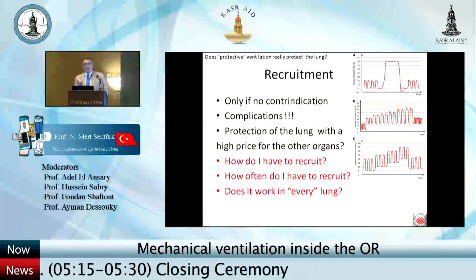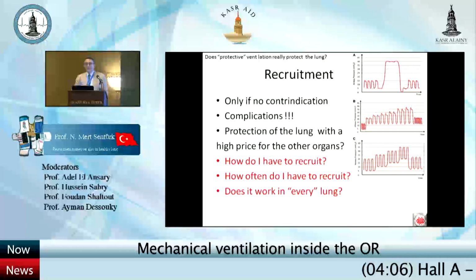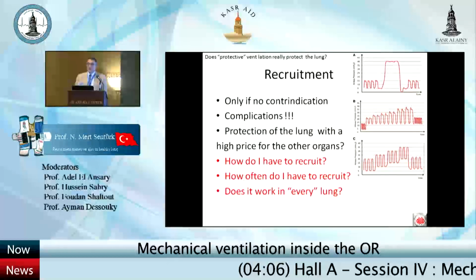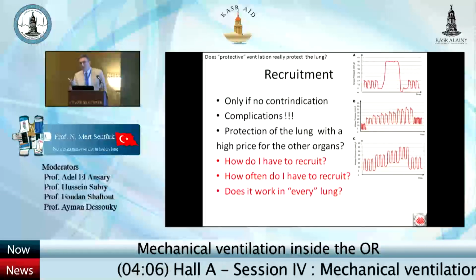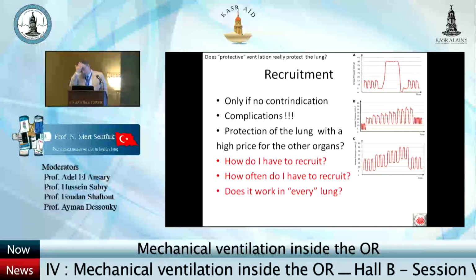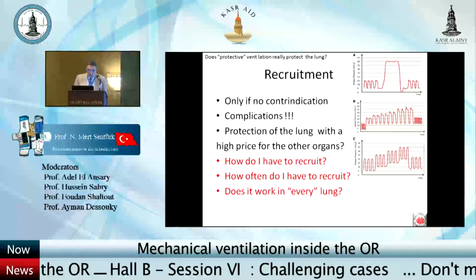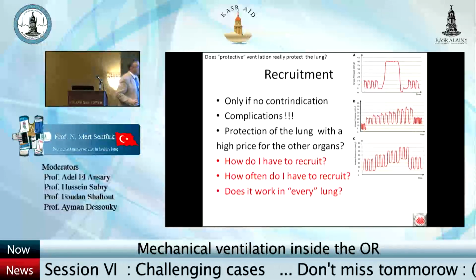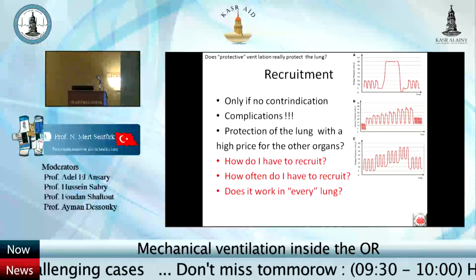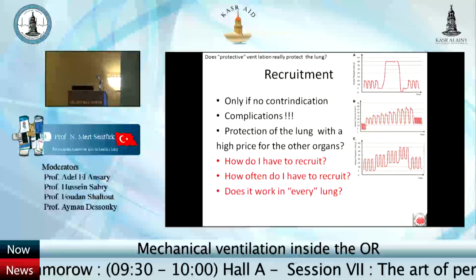Therefore, it is recommended not to use a recruitment maneuver immediately after the induction of anesthesia, because the induction of anesthesia, especially in critically risky patients, can be associated with hemodynamic instability. So how do I have to recruit? We have already mentioned that this method is probably the best method to apply a recruitment maneuver.